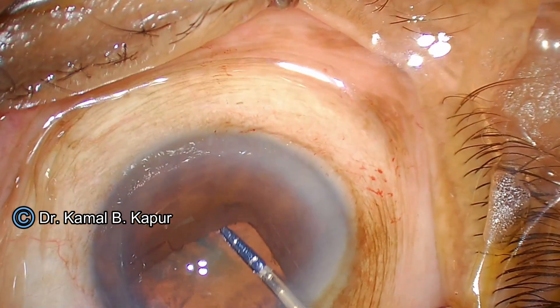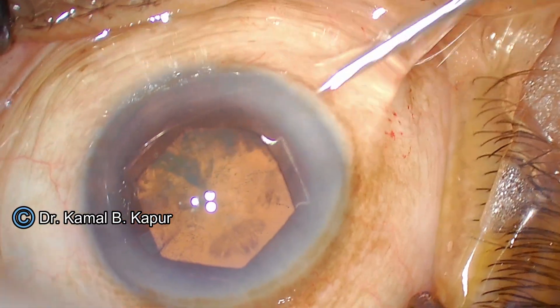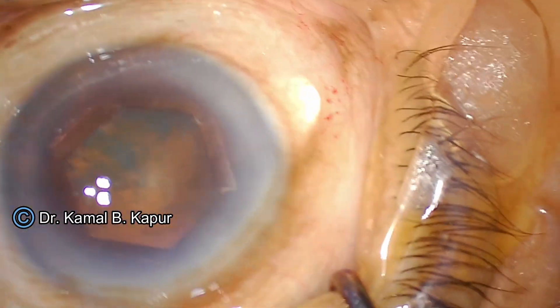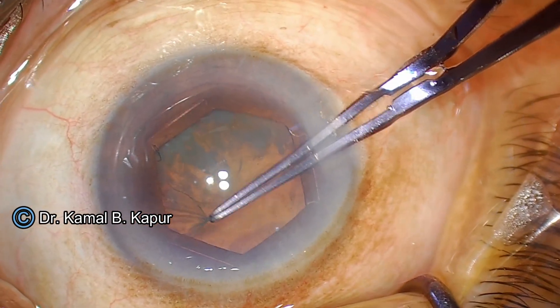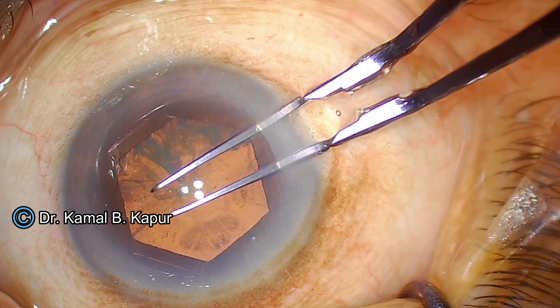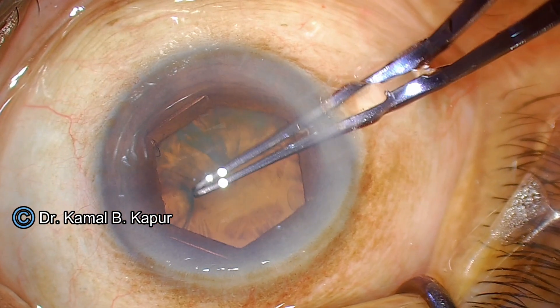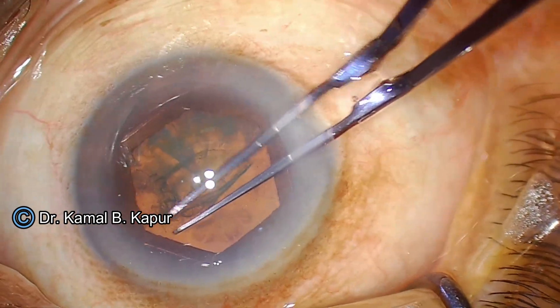Once the pupil expander ring is in place, I find this device to be very useful, interesting, and easy to use. You notice that the capsular bag is very loose — I will show it in slow motion rewind. There you saw.